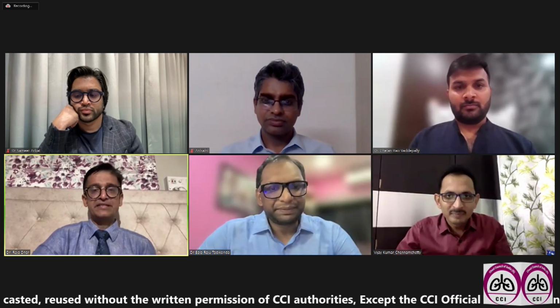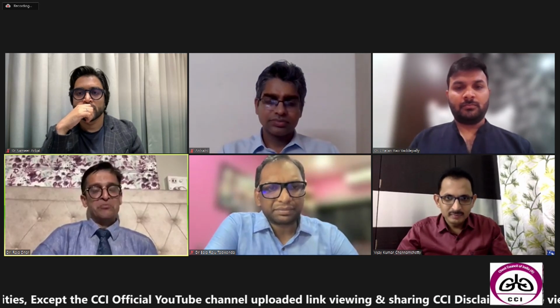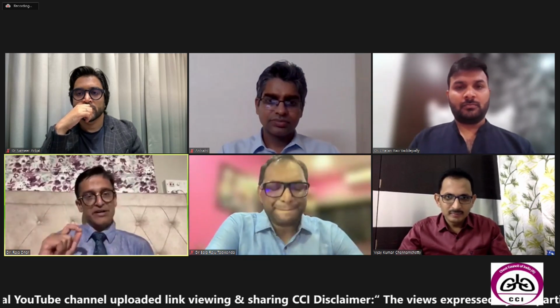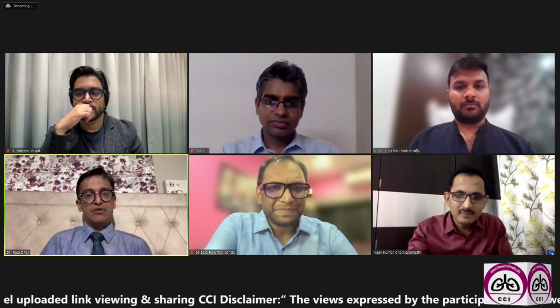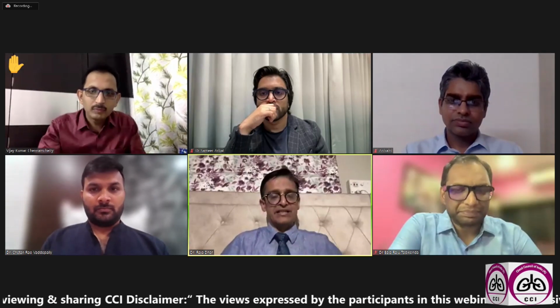Yeah, no, fantastic. So one point that Bala makes, an important carry-home message for the audience, is that people who want to do cryo, the ones who have started doing them, do use a fluoro. With a lot of experience, you will probably learn how to do it without a fluoro. But the important thing is take your time. It doesn't matter if you're taking 40 minutes rather than 20, but try and be safe as far as possible. Safety matters. And I think safety does increase when you're using a fluoro, especially with your initial procedures and your learning curve. I think that's very important.